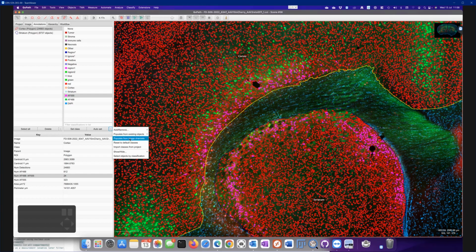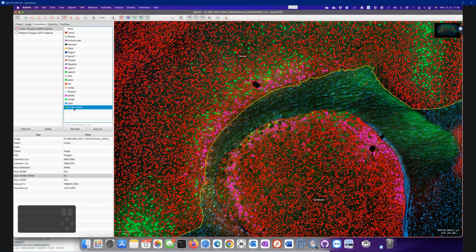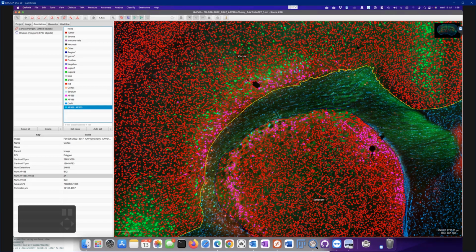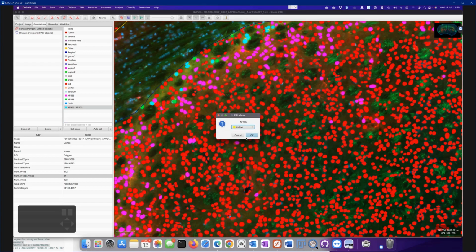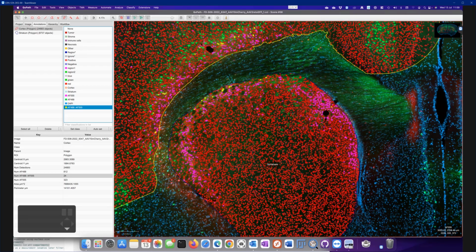Actually, if you populate from existing objects, including the subclasses here, I want to keep the existing classes and press yes. Yeah, you get now the double classified here. So I can give those a specific color. Let's put them, I don't know, in cyan, something that would stand out. Probably. And do we see some of them? Yeah, here they are. Or even if you put them in yellow, it's probably even a better idea. Like this. So now we see them. So that's how we should work.